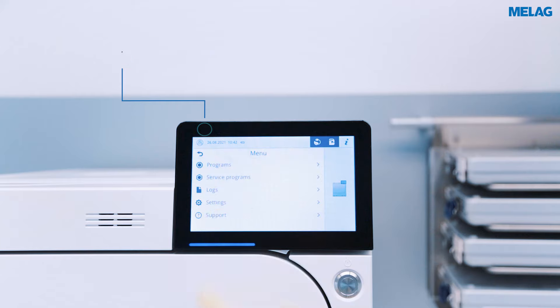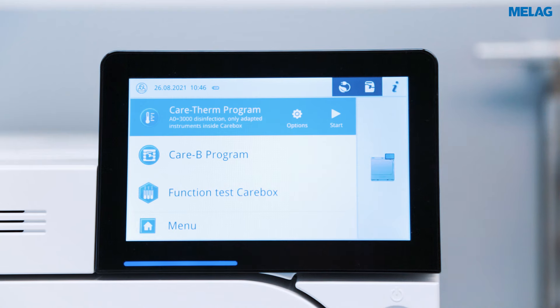You'll find all other programmes and settings in the main menu. You can either start a selected programme directly or adjust it under options.